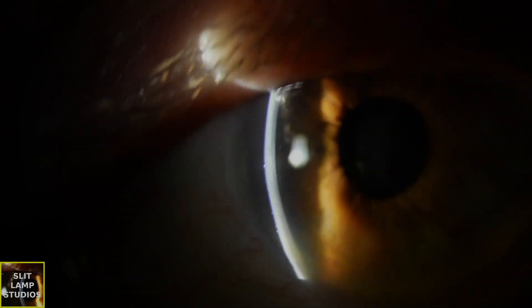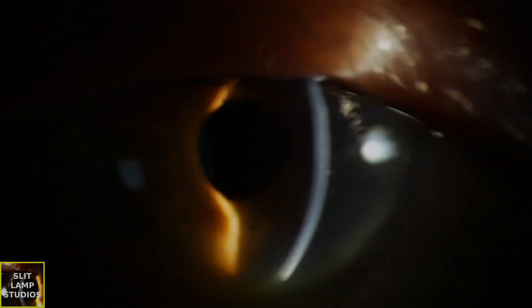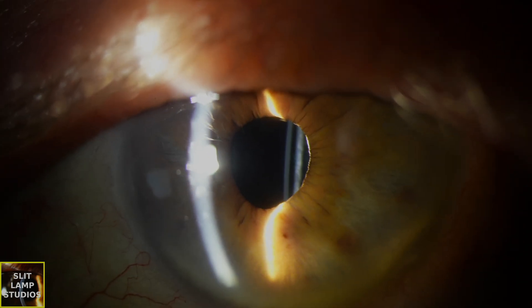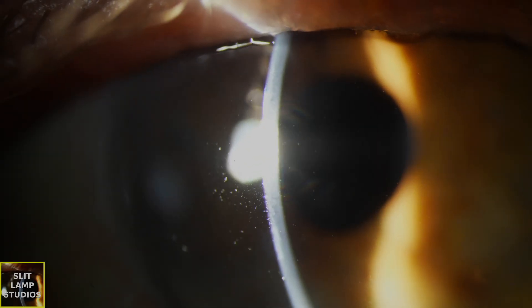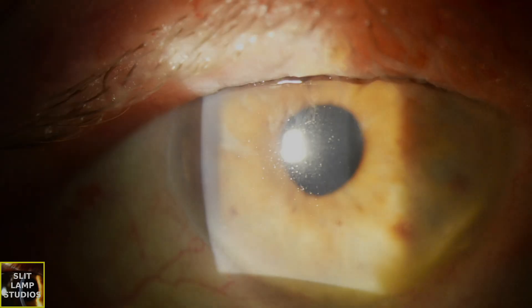We use the slit lamp with diffuse illumination to evaluate the surface elevation, and then we can use a Seidel's test with fluorescein to check for any leaks. A successful bleb is often elevated, diffuse, and avascular, indicating good filtration.